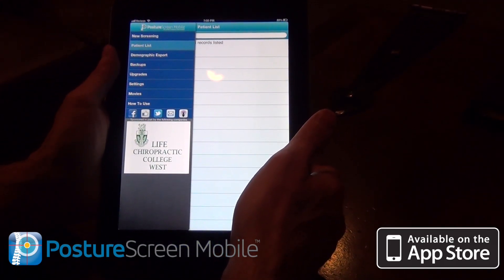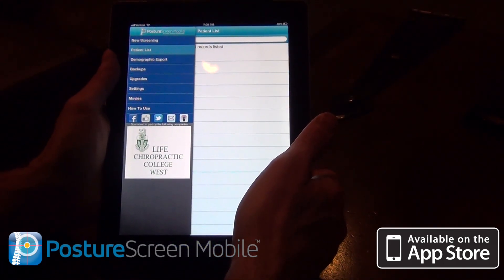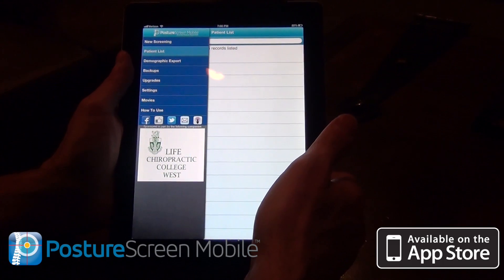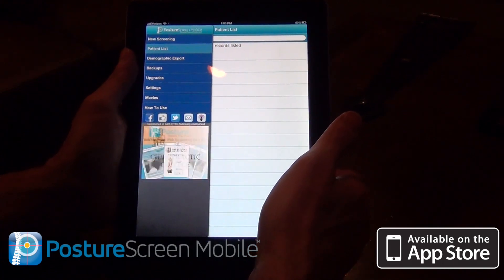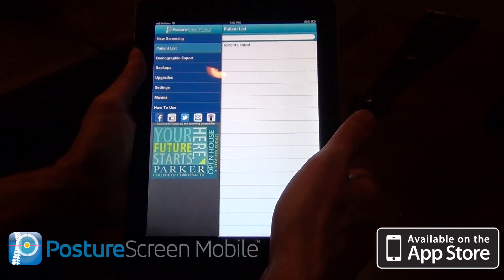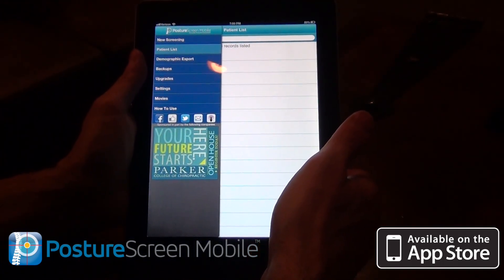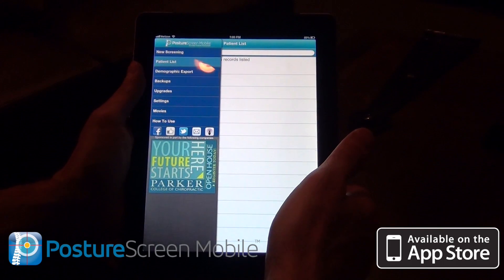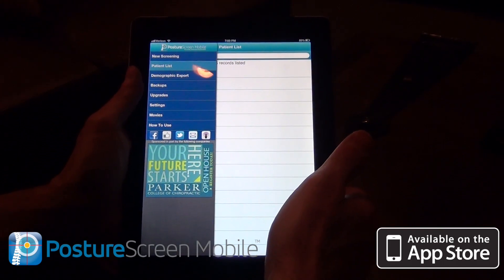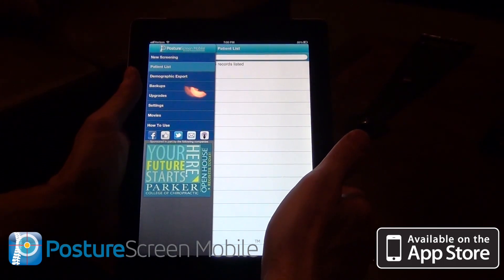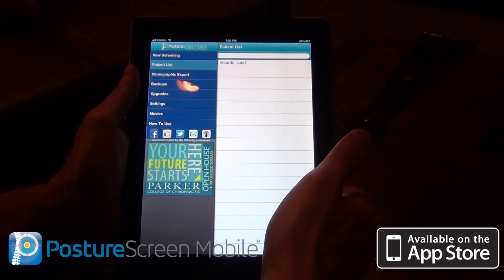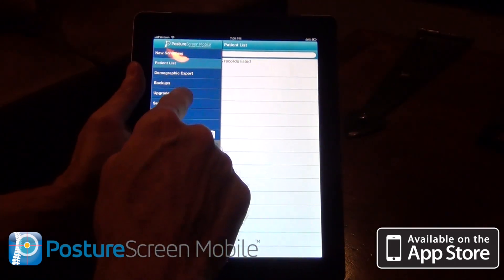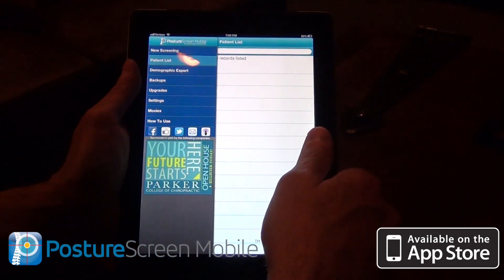One of the new exciting features of Posture Screen Mobile is the addition of motion capture analysis for the purpose of functional movement assessments, screenings, and evaluations. It's just a one-time upgrade purchase through the in-app purchases under upgrades.